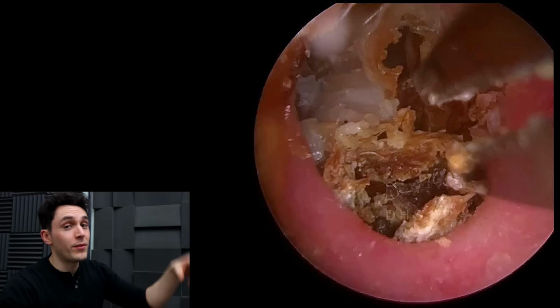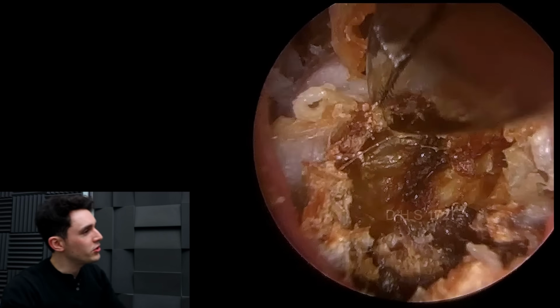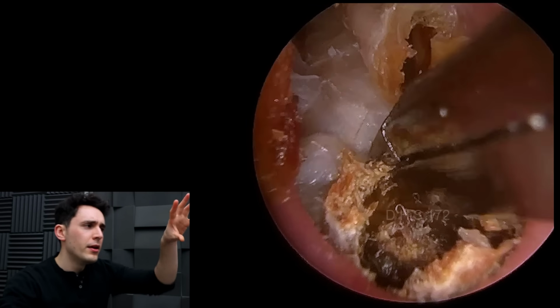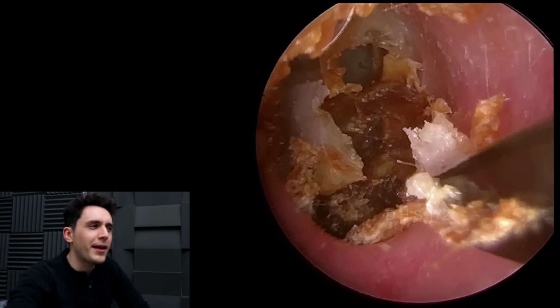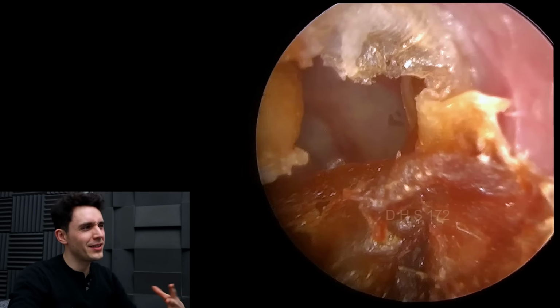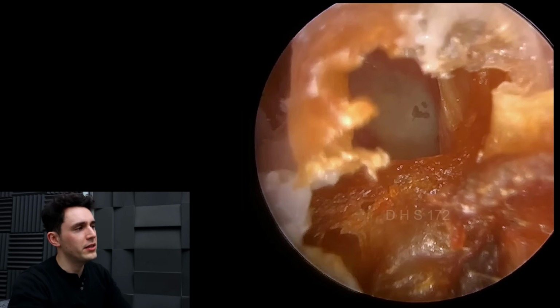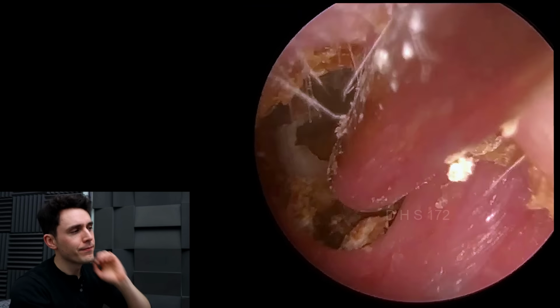So the first time I saw them, I thought that there would be pus and granulation tissue and so on and so forth. But strangely, no. And when I dug all this out, again, it doesn't seem infected. There's no pus, there's no odor, there's nothing that would make you think, wow, this is a really bad ear infection, which it should be, but it isn't. Eardrum back there, looking okay.